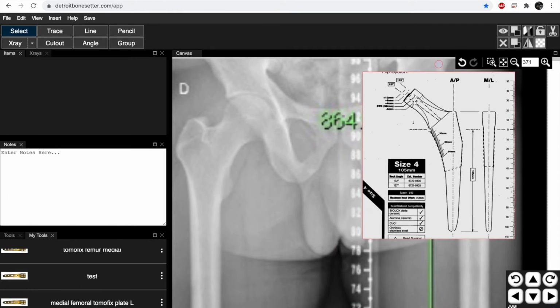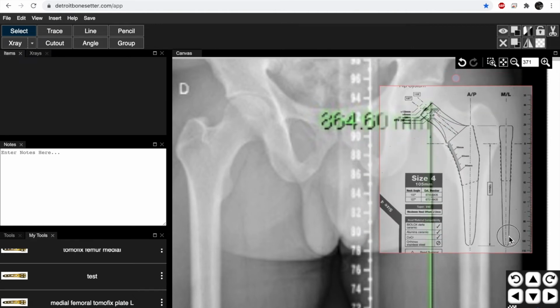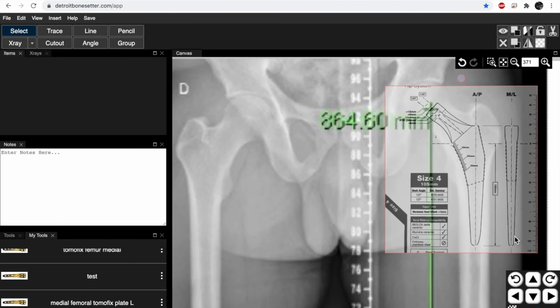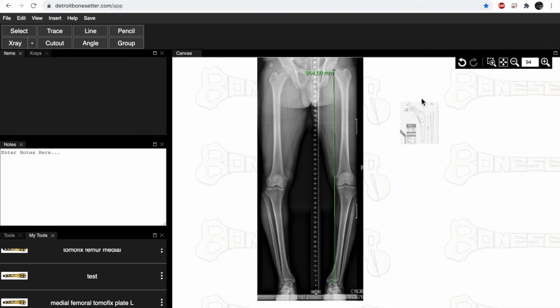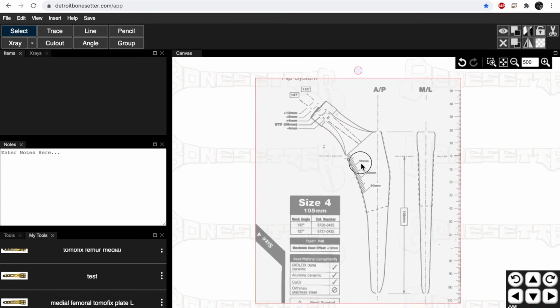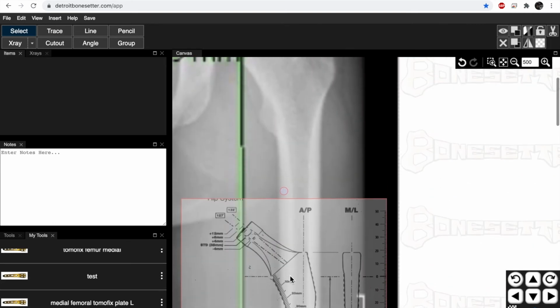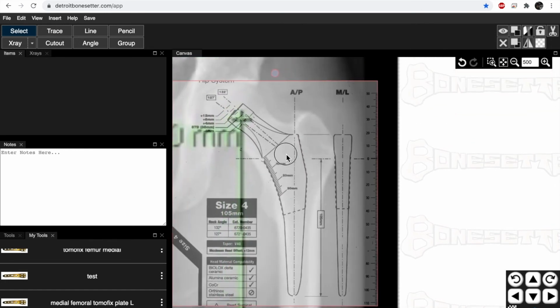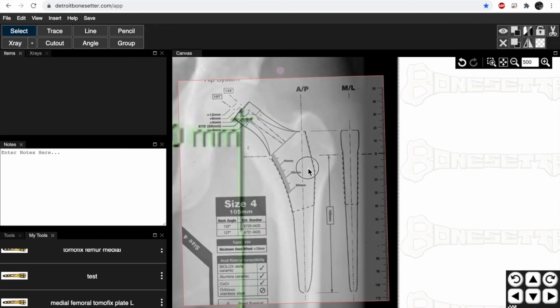So what I can do here is I can make it transparent. So down here, when I select this, it has a little red ball. I can make it transparent. So now you can see through it. Now, if you don't mind it being that transparent, you can save it. Now make it even more transparent. Here we go. Now it's fairly transparent, but I can still see the markings. And if I was going to bring it over to my hip, I can still see the markings. And there you go. I can see through it, and I can check. And this is essentially a template that I can put in, and I can do the same thing.